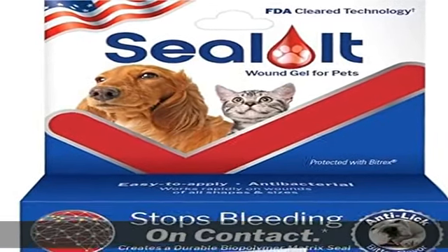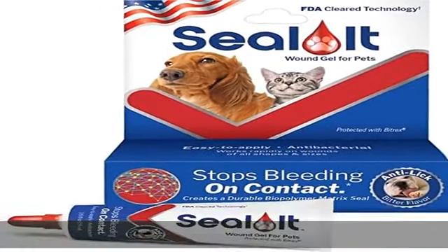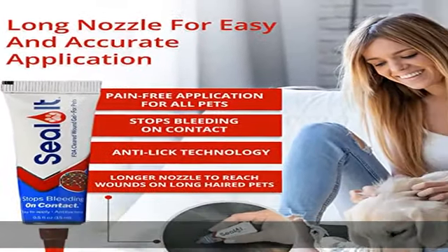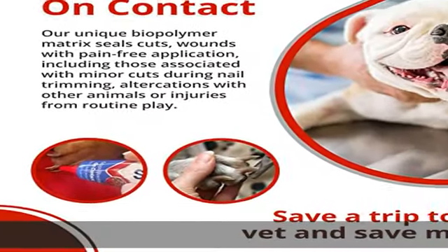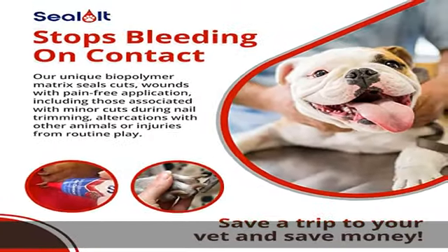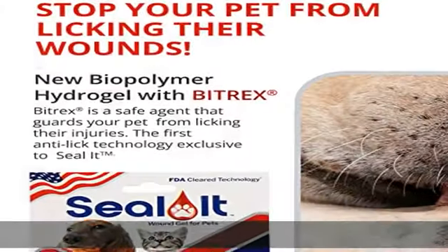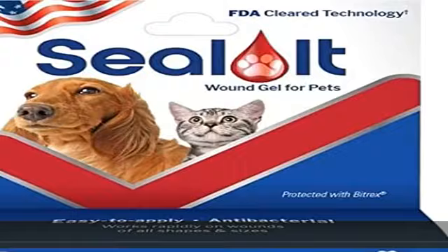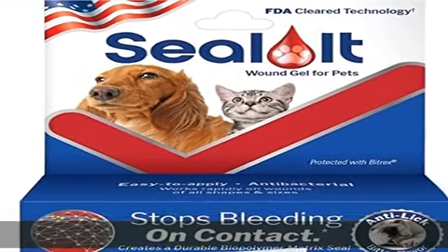Seal It pet wound care gel for cats, dogs, and all animals is an easy to apply, fast-acting way to stop bleeding on contact and seal open wounds. It acts like an invisible bandage, covering and sealing wounds while creating an impermeable barrier to dirt, bugs, and other foreign substances that may otherwise enter the wound.